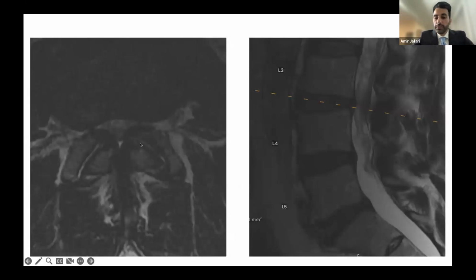So here's another example, another pathology, totally different patient. This patient had symptoms of back pain and leg pain, and you could see that this is facet joint hypertrophy. What you see here is facet joint effusion, a small amount of fluid. When you see fluid in the facet joint, you should start ringing bells in your head: is there instability or not? Because that means that joint is moving, it's angry, right? But not always. That's when I ordered a flexion-extension to confirm that.